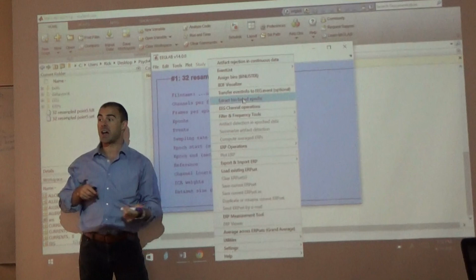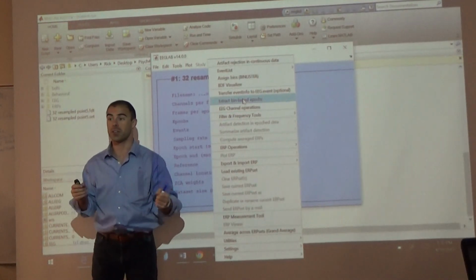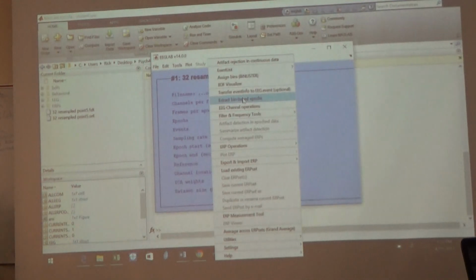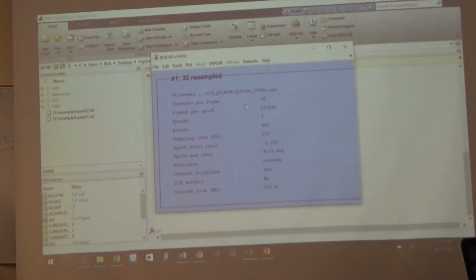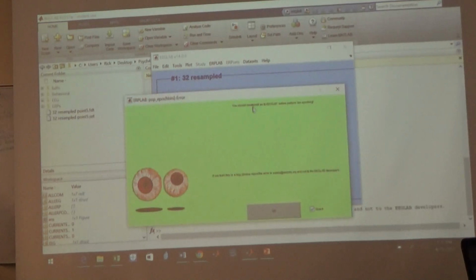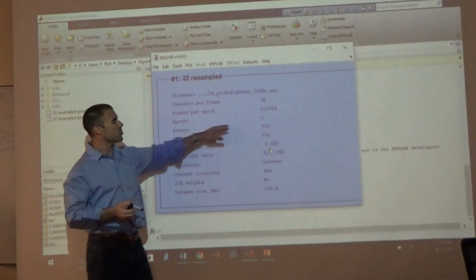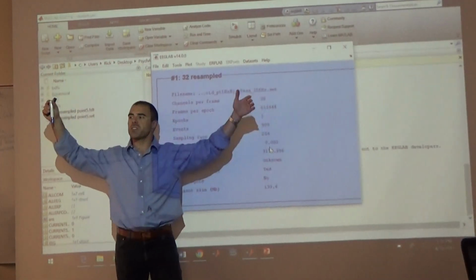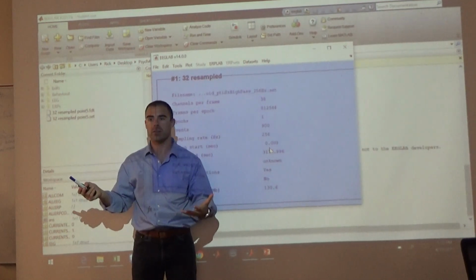Okay? So as it's suggesting, we're pulling out epochs in the data. Now click on that and let's see what happens. Oh, no. We have to create an events list first. Well, golly. We want to epoch the data not just in one long slice, but we want to slice it up into all of our events, right? Why wouldn't it let us do that?